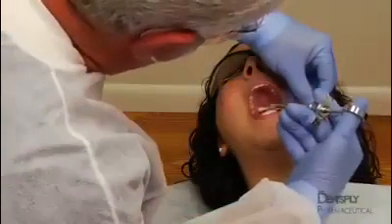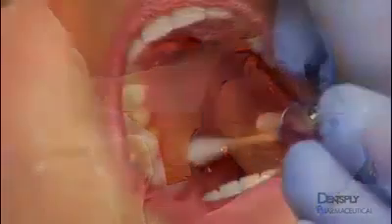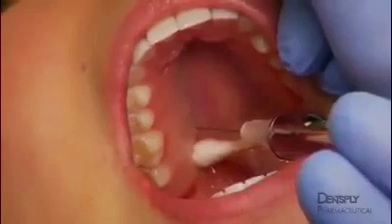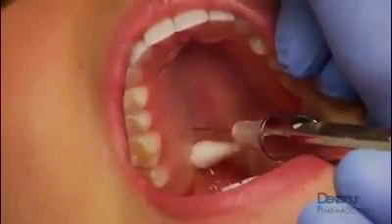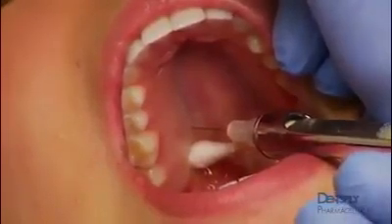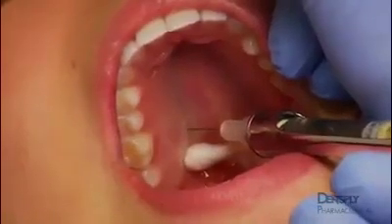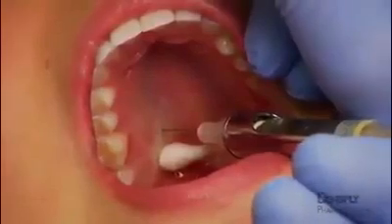Using a 27-gauge needle, direct the syringe from the contralateral side of the mouth at a 90-degree angle to the palate toward the cotton-tipped applicator. Insert the needle slightly anterior to the greater palatine foramen 3 to 6 millimeters until the palatine bone is contacted. Aspirate, then slowly deposit approximately 0.45 milliliters of solution, about 1/4 of the cartridge.